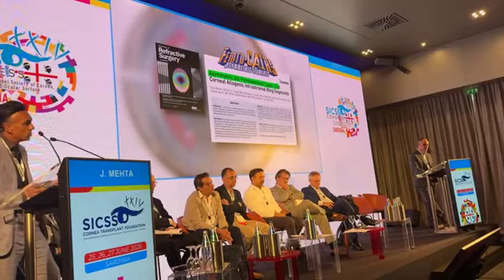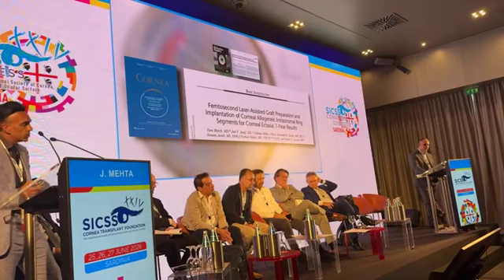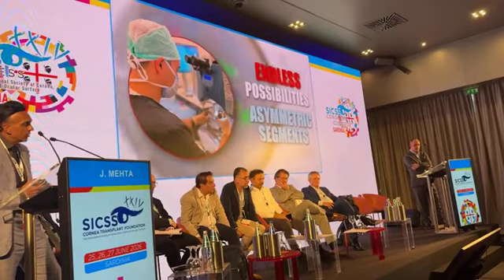And back in 2023, he published the first publication showing you the outcomes of these asymmetric or femtosecond laser segments as well. And I'll show you some data to show you how this works. And this was followed up with another paper looking at 1-year results, again using femtosecond laser cut tissue and femtosecond laser preparation for the incision as well. And this just gives you an example of what you can do with these asymmetric segments.